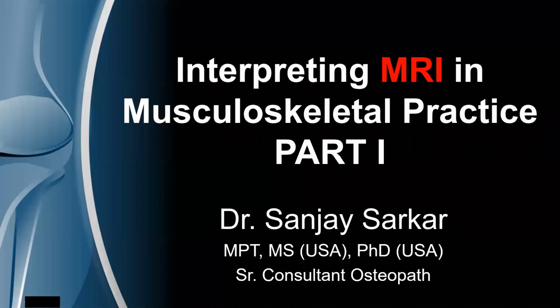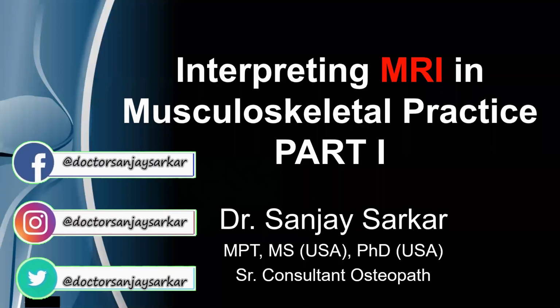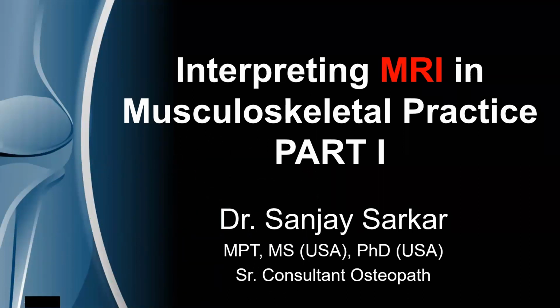And then obviously, if there is an X-ray, you are also checking the X-ray. Then MRI comes into play. It's like the 4th point down your evaluation screen. That's where you are seeing the MRI. So in your mind, you already have some kind of structure that will help you understand, oh, this might be the problem or that might be the problem. So you already know what you are looking for.